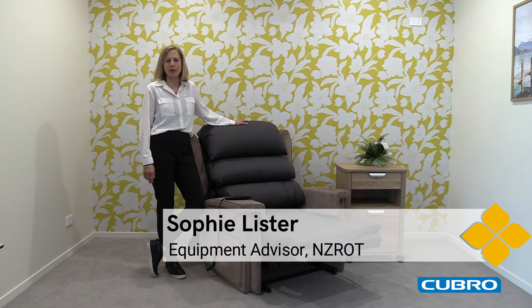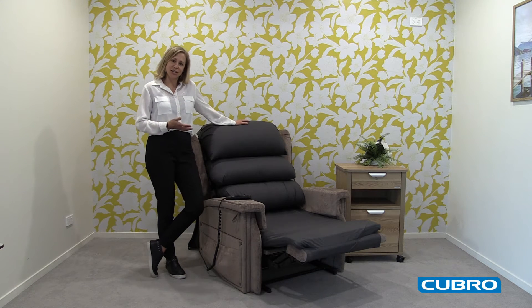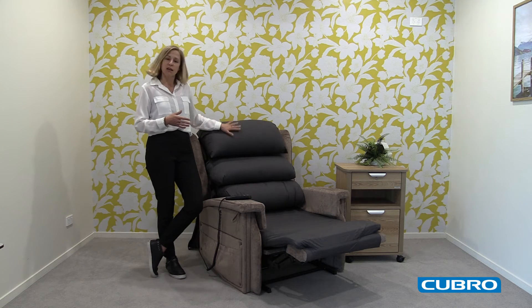Hey, I'm Sophie from Cubro, and today I have the Configura Bariatric Rise and Recline chair. This chair has a safe working load of 254 kg and has been designed with incredible pressure management already as standard.